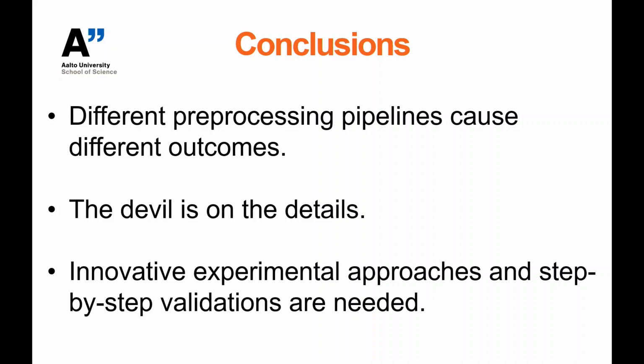Then there are a set of artifacts where I think ICA is much better suited, like ocular artifacts that do happen spontaneously and more randomly and can be assumed to be more independent. So I think it's hard to compare them at the moment objectively, but I think these methods that I described at least give you options in addition to assuming statistical independence between the components.